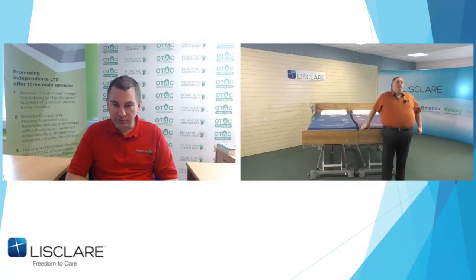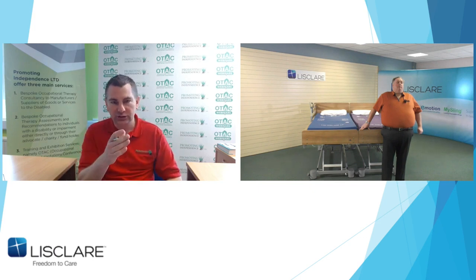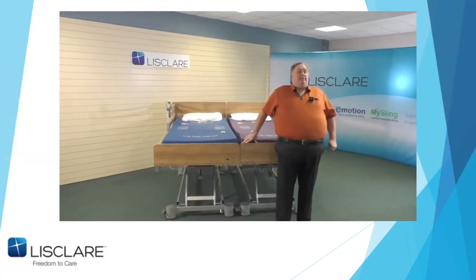Okay, couple of other questions, Keith, but just one off me, if I may. If you have 2 disabled people in the bed, I noticed your daughter then removed the partner section and then moved the bed across. How much space extra would you need if you had 2 disabled people using the bed? It's no different. It's still 246 because we work on each individual patient separately.